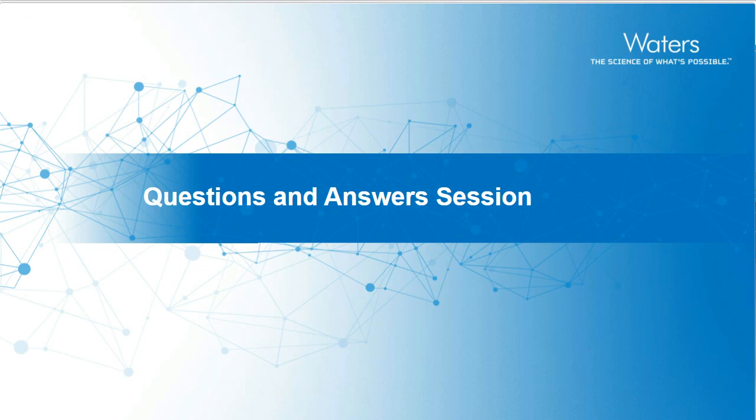There's one sampling taken of the lock mass at the beginning of the sample and one taken at the end. That's the default. You can actually modify that and have it sample as often as the user wants, really. So the short answer is yes, we do use lock mass. Okay, thank you.